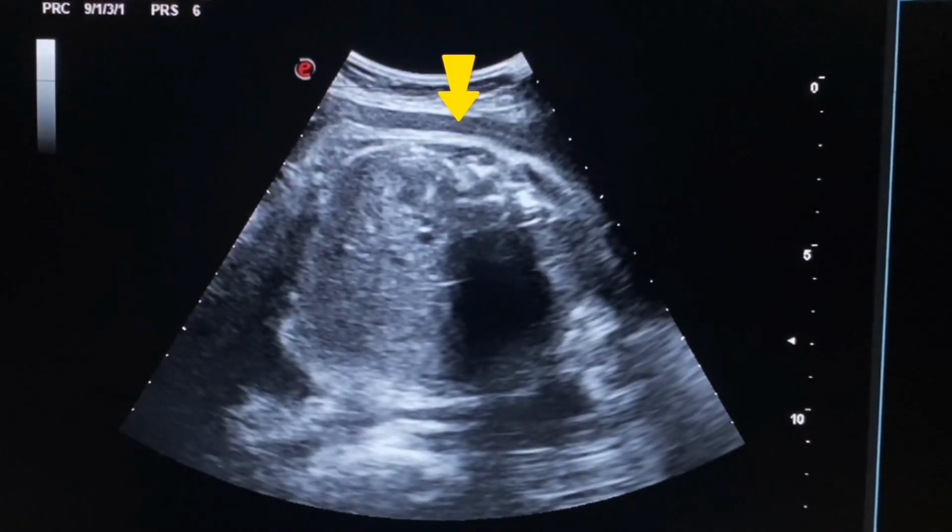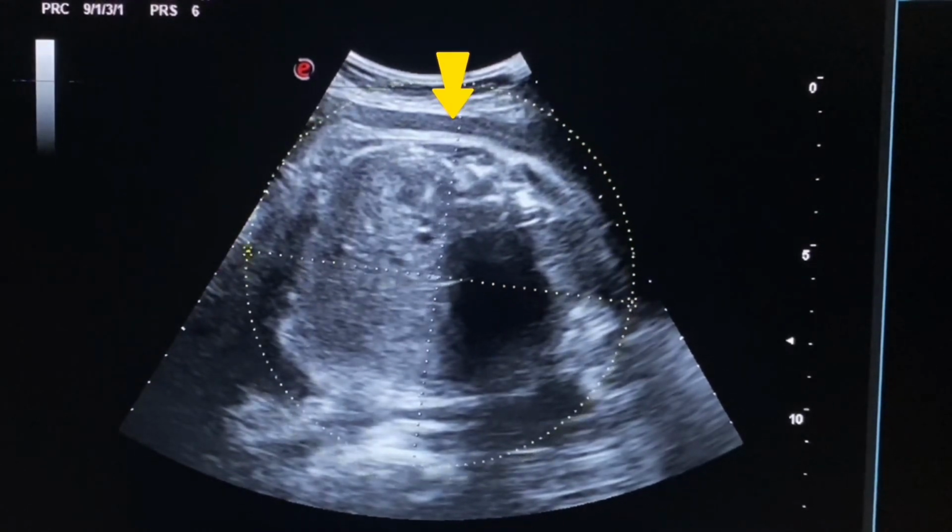As the patient is lying in slightly lateral position, here we see the vertebrae and this is gastric bubble. For abdominal circumference, we will take the cross-section view of the abdomen.